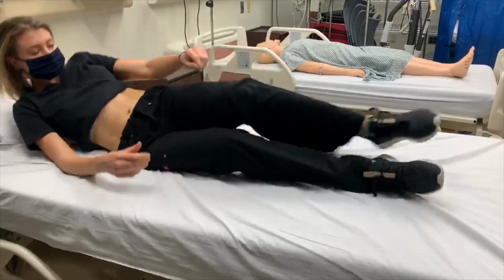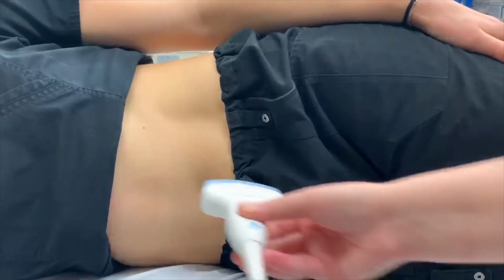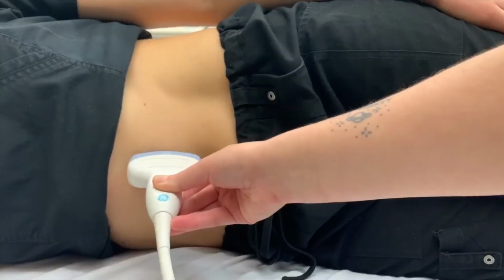The patient should now be placed in the right lateral decubitus position. The steps performed in the supine position will be repeated.